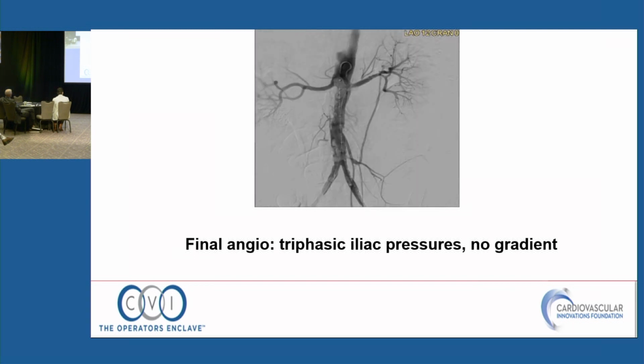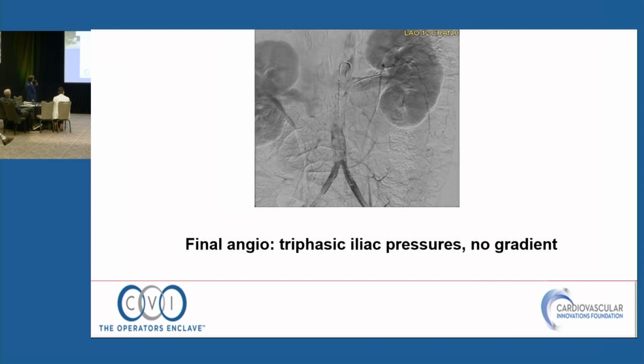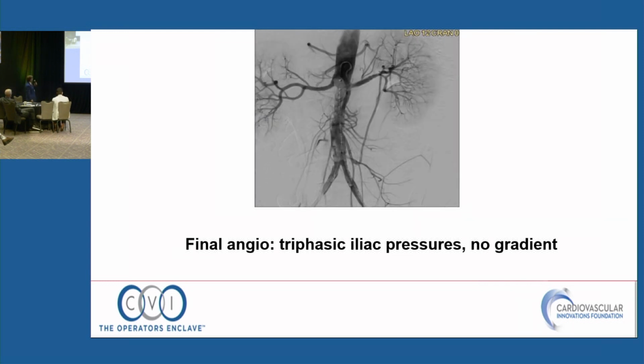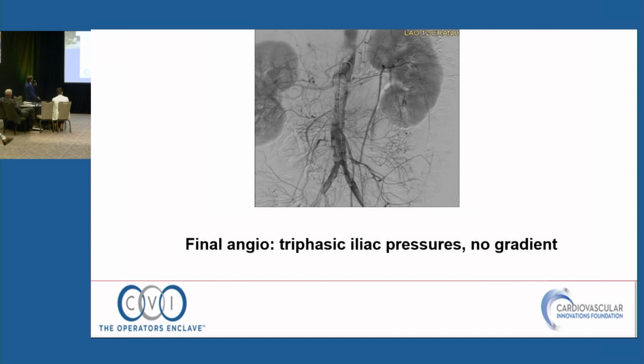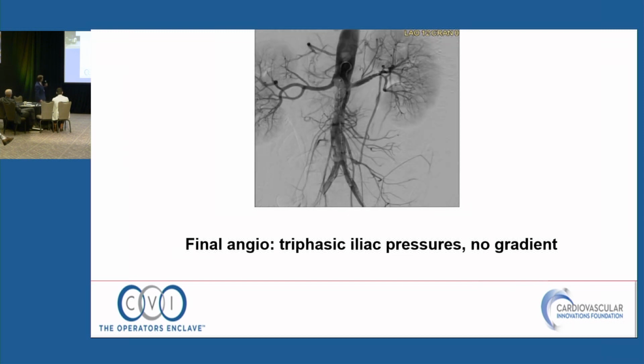Large fistula. No, I don't think so. Just the kidneys. There's a little one, but I don't think there's a... You're sitting over here. Being a case. Yeah. It's just the... Oh, so we do have that. You're correct, filling up on the right side there. You know, and again, is that enough to do something different? And I have to go back.